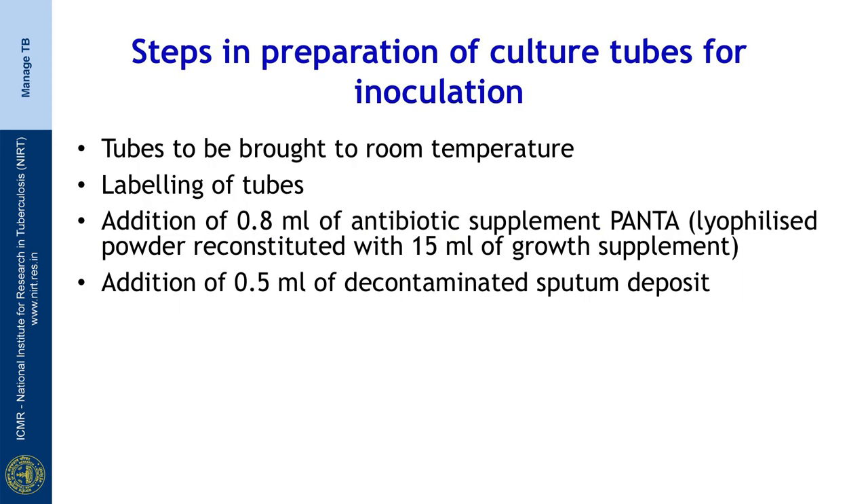MGIT tubes are usually stored at a temperature of 4 to 8 degrees. For raising a liquid culture, the tubes have to be brought to room temperature and labelled properly.